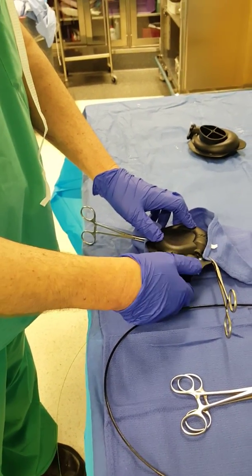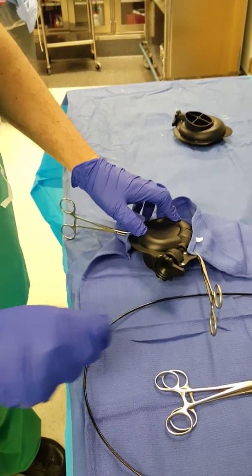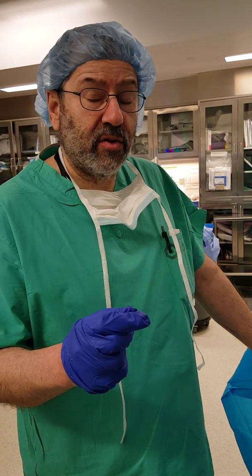To reuse the laser fiber, you now twist the latch clamp to the left and pull the laser fiber out. It is now ready to be used once again in your surgical procedure.